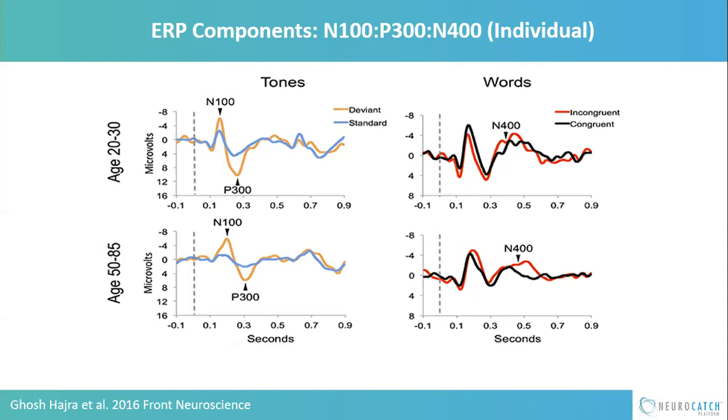That's auditory sensation. We increase the loudness, bigger component. And because it was unexpected and it was a deviant, they create an unexpected, aha, what was that? The stick snapped in the woods. That's why you see the separation between the standard and the deviant. So now I'm training your eye to look also at the difference between the two conditions.